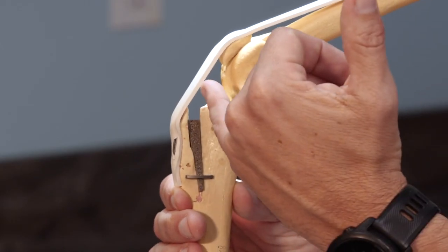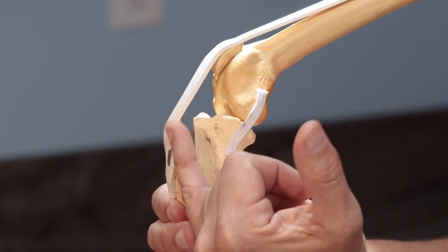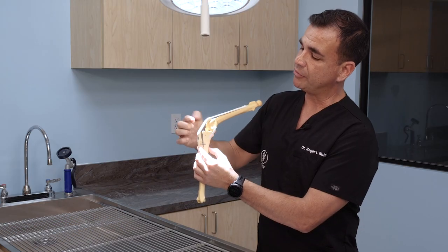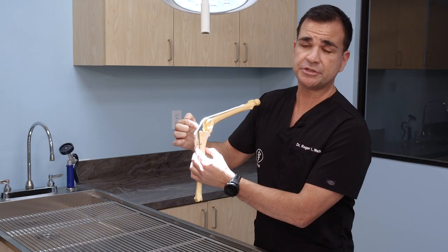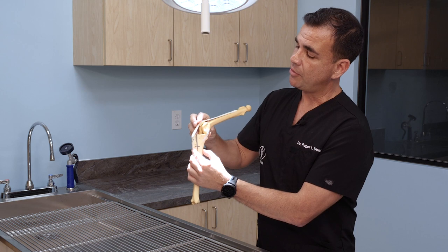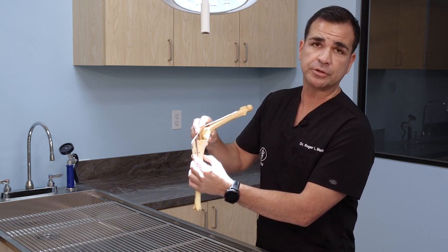We start with a simple cut in the bone here known as an osteotomy. We advance that bone forward, thereby creating tension on the patellar tendon. The patellar tendon is very thick and very strong, and essentially that tension will stop the forward movement that was once created by the torn cruciate ligament.